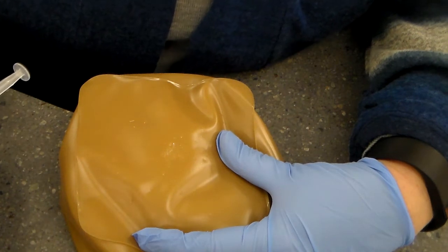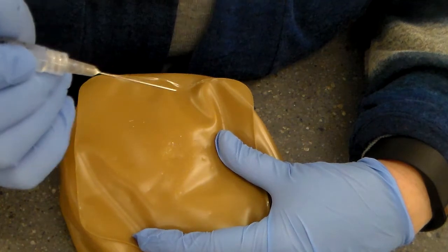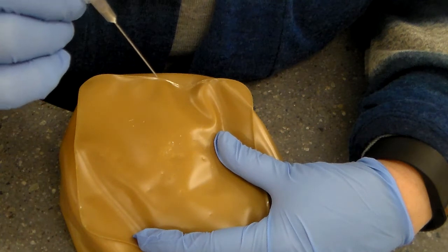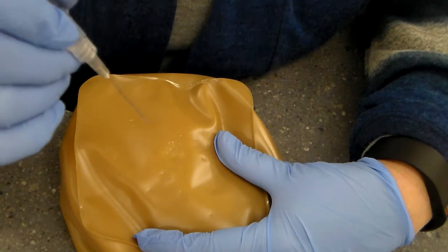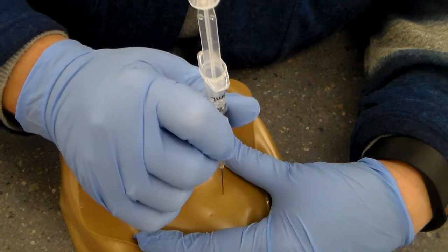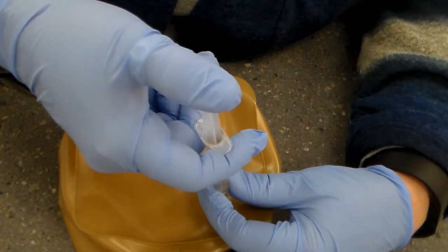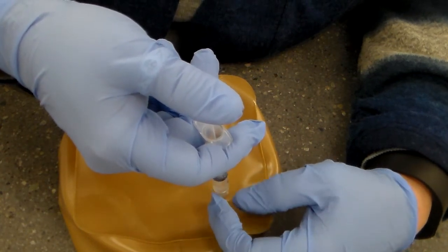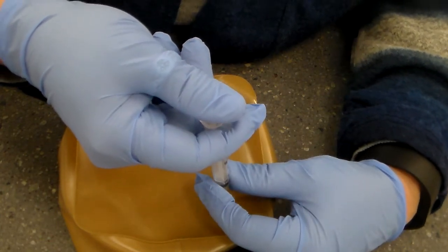Then we're going to ensure the needle placement and insert the needle at a 90-degree angle. Again, the PowerPoint presentation I gave you shows the different angles for injection, so look at that if you don't remember. 90-degree angle in, quick, all the way down, inject slowly and steadily. Slow and steady.